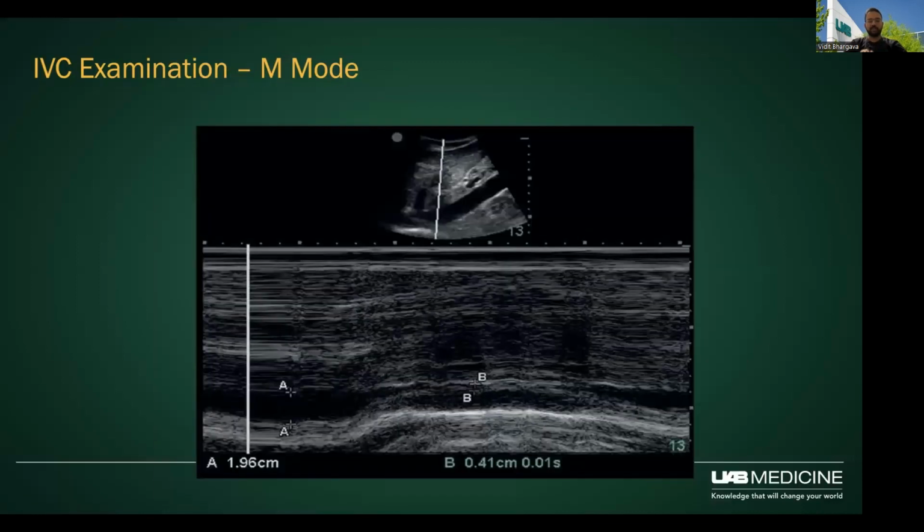And so in those cases, I have now started using IVC diameter measurements in the transverse plane, like we did for IVC aorta ratio. In that case, you're able to see if the IVC is moving in and out of the plane with respiration versus there is an actual true change in the size of the IVC with respiration.